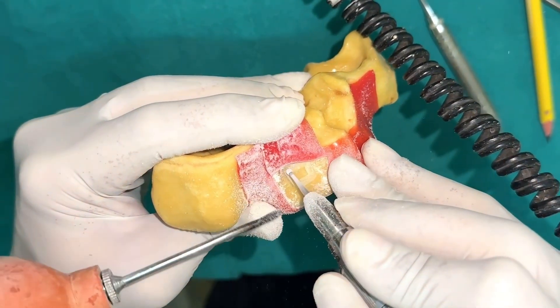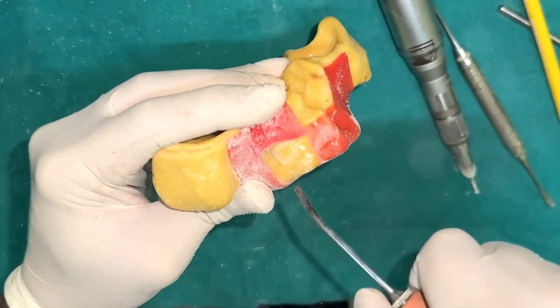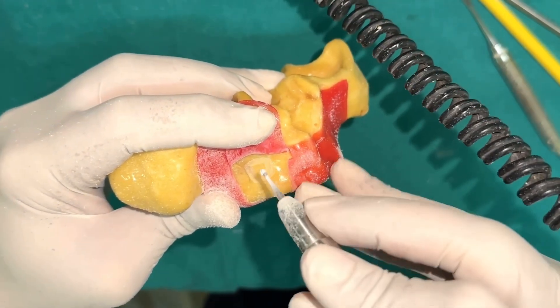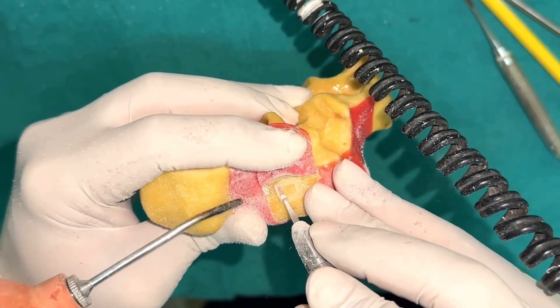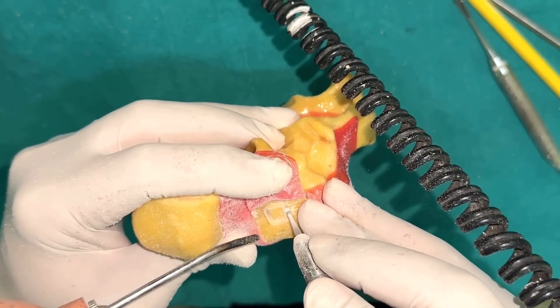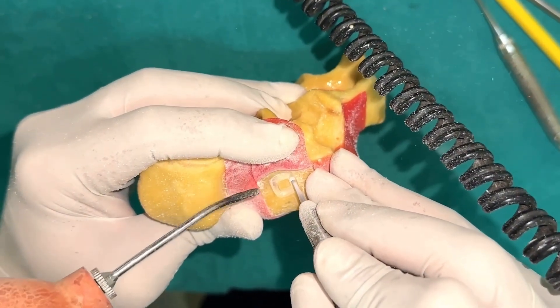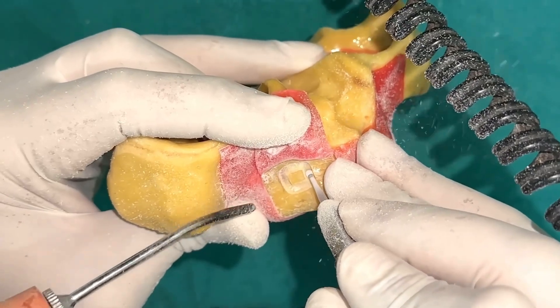Once we clear off the site, the outer window outline has been made. Now we have to go deeper into this outline, and again shaving strokes have to be done. As we do these shaving strokes, we will be seeing a sort of dark outline of the Schneiderian membrane in the patient's mouth. We are still in the bone at this stage, so we are not yet able to see that outline, but pretty soon we should be encountering the membrane.